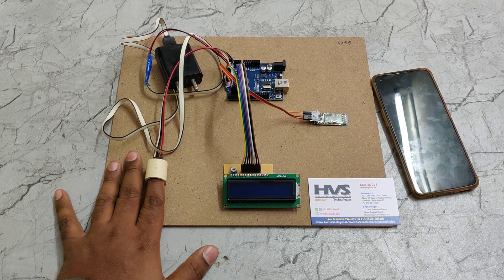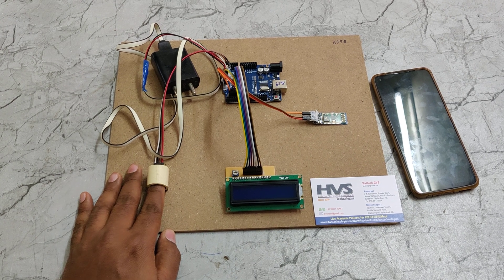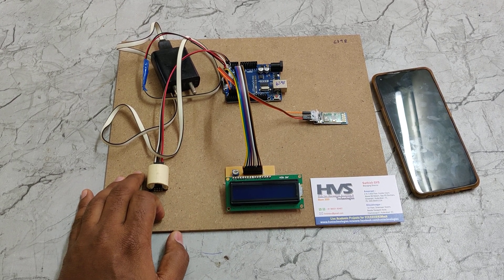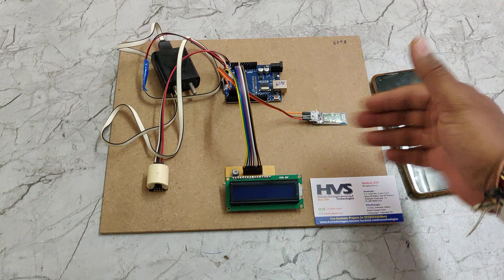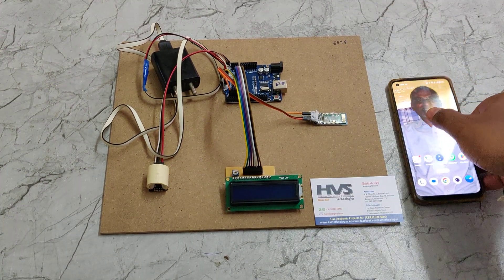When we place a finger inside the sensor, it starts reading input from both the phototransistor and LDR sensors and calculates the density of the blood. It then checks against predefined values stored inside the Arduino board and estimates the blood glucose levels, which are displayed on the 16x2 LCD screen.